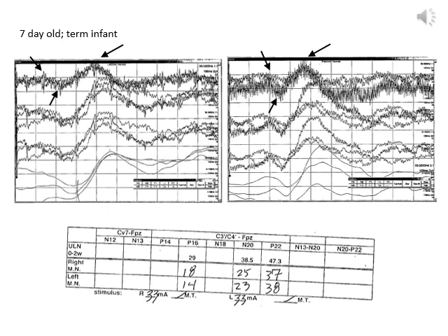So in this recording, we'll see that the technologist has given us the latencies for the P16, N20, and P22 for both arms, and they are below the upper limits of normal. And so this is a normal bilateral recording.